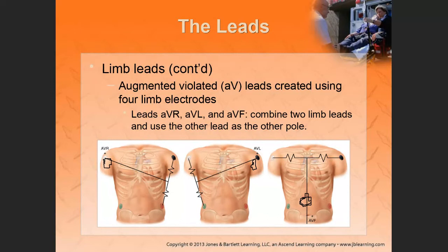That's the first question. Answer quickly. Right? So I would be using 4 electrodes or 5, but 4 is more commonly used in the pre-hospital setting. You'll see 5 electrodes in the hospital setting. So more commonly it would be 4.